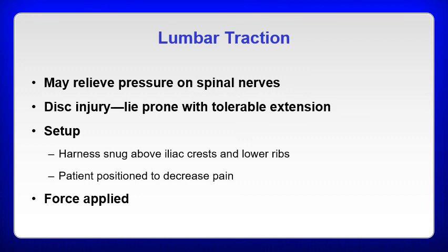But again, put them in a position of comfort. If you lie them prone, even if you're really certain they have a disc injury, and they're not comfortable there, then it really doesn't make a whole lot of sense. Just put them in a position of comfort and do the treatment, but that would be your starting point. For the setup, again, you want the harness to be snug above the iliac crest. Again, if you could get it skin to skin, that's the best. And again, position the patient to release pain.